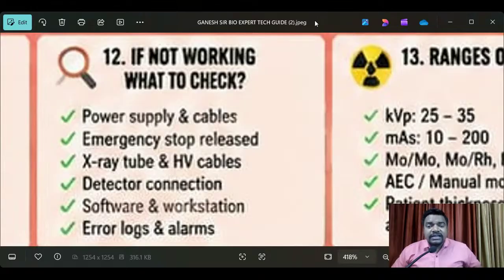Whenever we get a complaint from the hospital technician, like the mammography technician, understand? These equipments are very, very important. Radiology medical equipment is diagnostic services equipment, and hospital revenue depends completely on it. So whenever you get a complaint from the radiology department, don't delay.